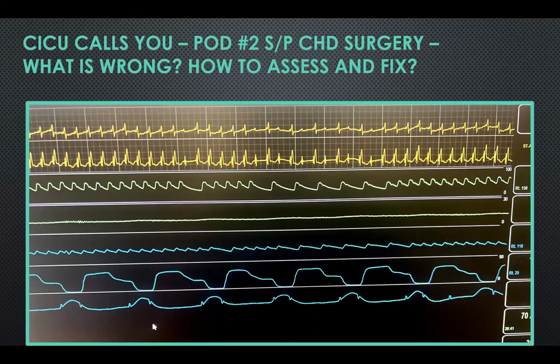And that's part of the reason why we always program the device at double the threshold. The assumption is that the threshold you're measuring is not going to be consistent all the time. If it were, then it would make no sense to do it at double. You should just do it as one-tenth of a volt higher or a milliamp higher than the actual threshold.